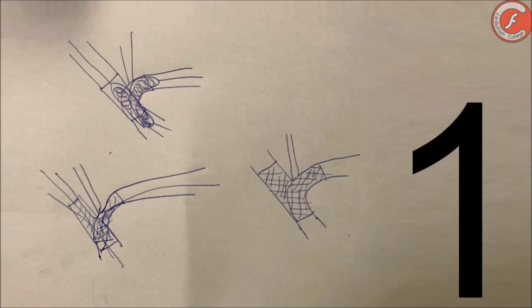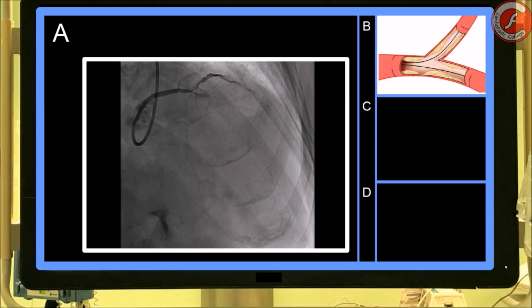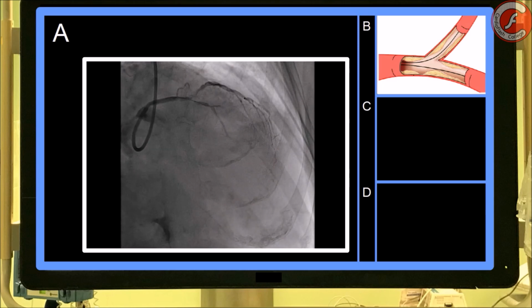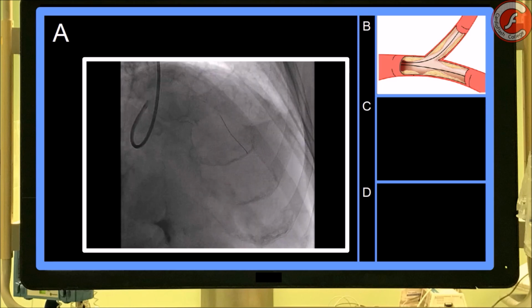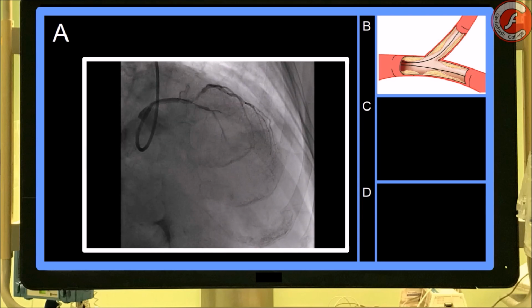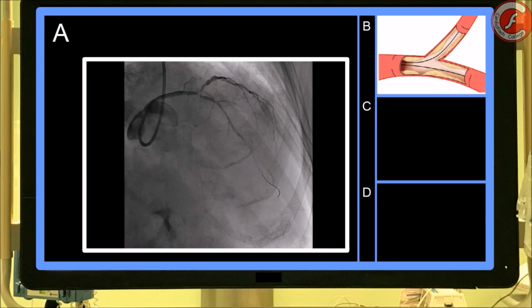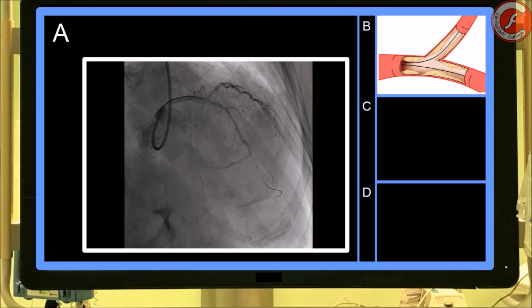Step 1. An angioplasty guide wire is introduced in the main branch and another one into the side branch. We recommend using the first guide wire to navigate through the branch with the most severe or complex lesion, so we have full freedom of movements. The second one shall be introduced carefully, avoiding rotation movements that could include the first guide wire.